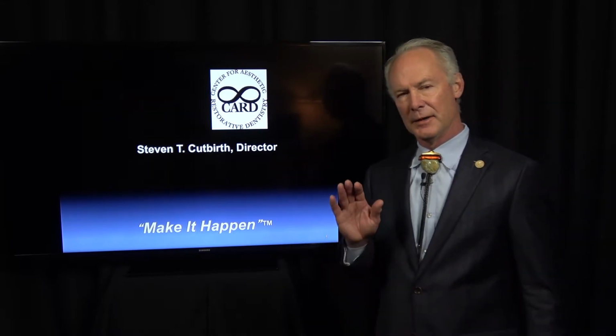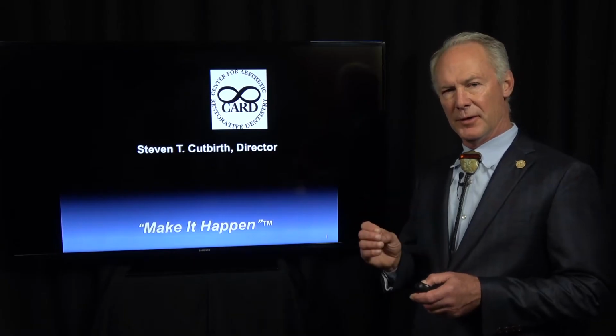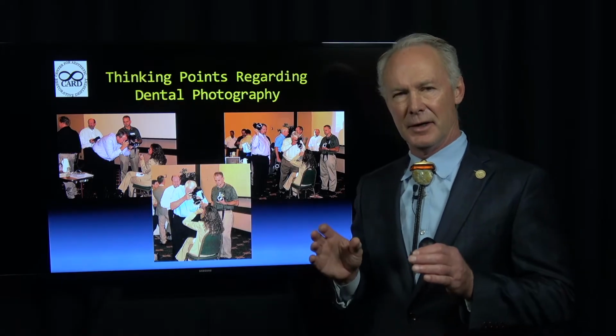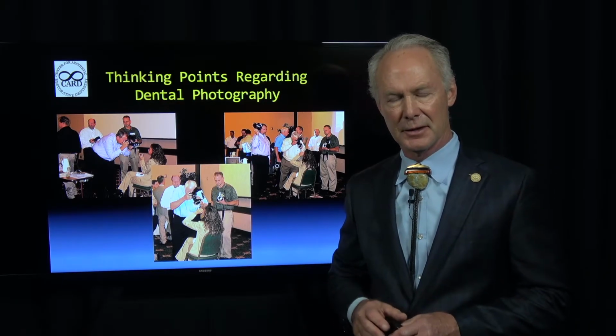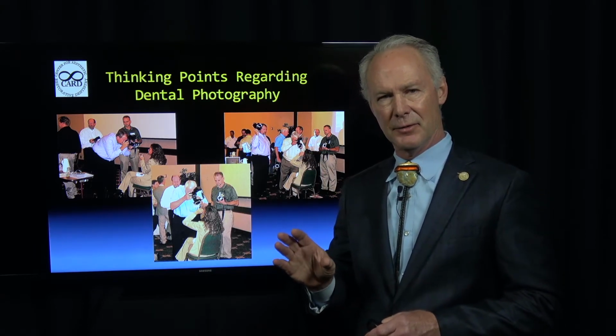Hello, let's talk about the photographs you should take during the new patient examination to be used during the new patient consultation. I'm going to talk about what photographs to take and how to take them. Excellent dental photography is a critical part of a comprehensive dental practice. I'm going to show you the 12 photographs to take on every new patient and how to take them.